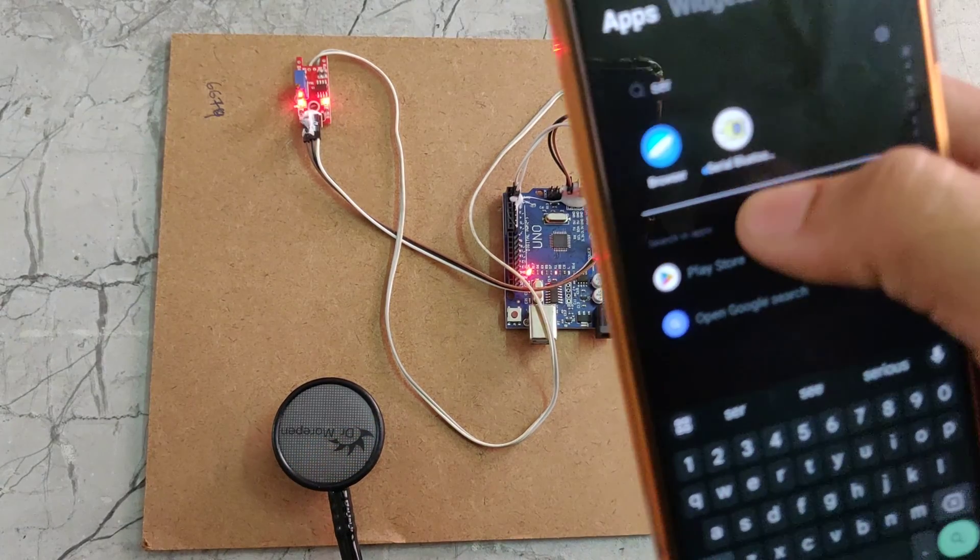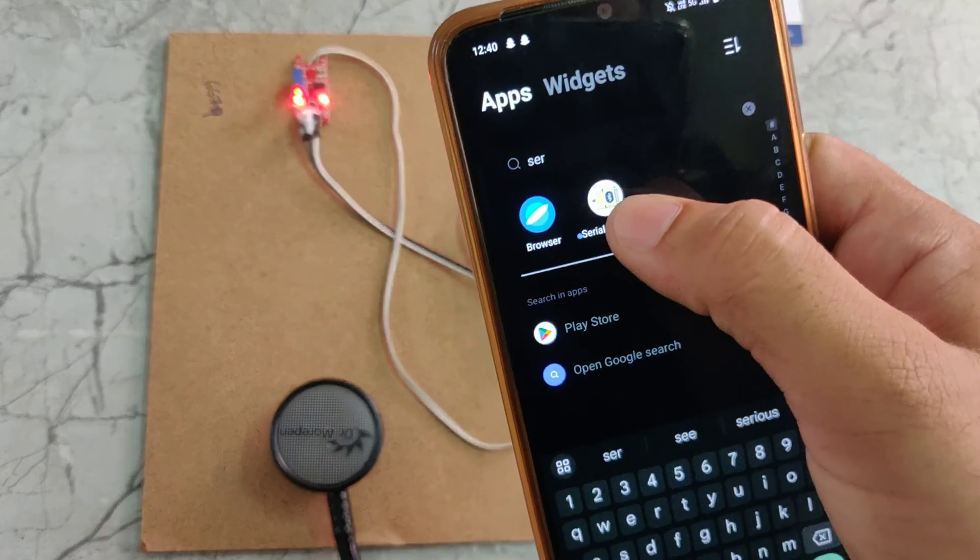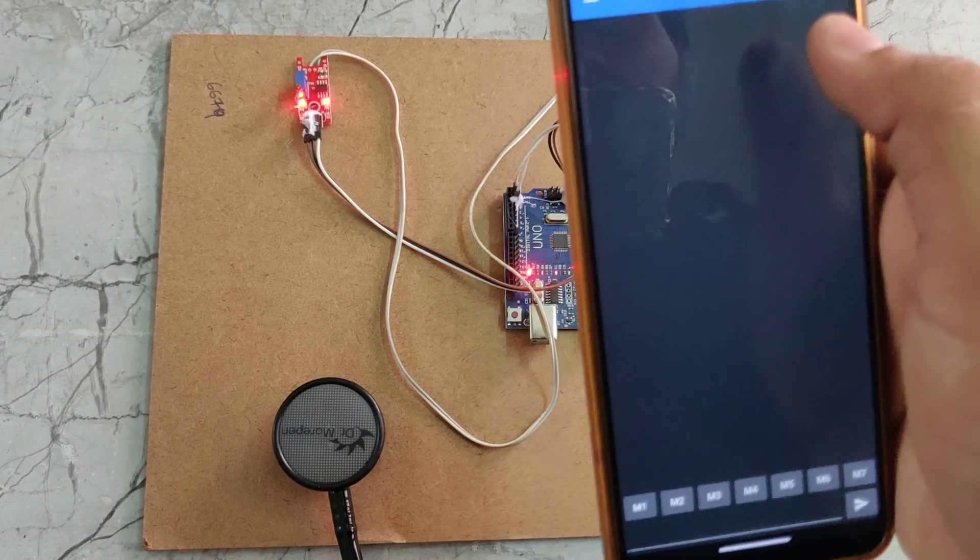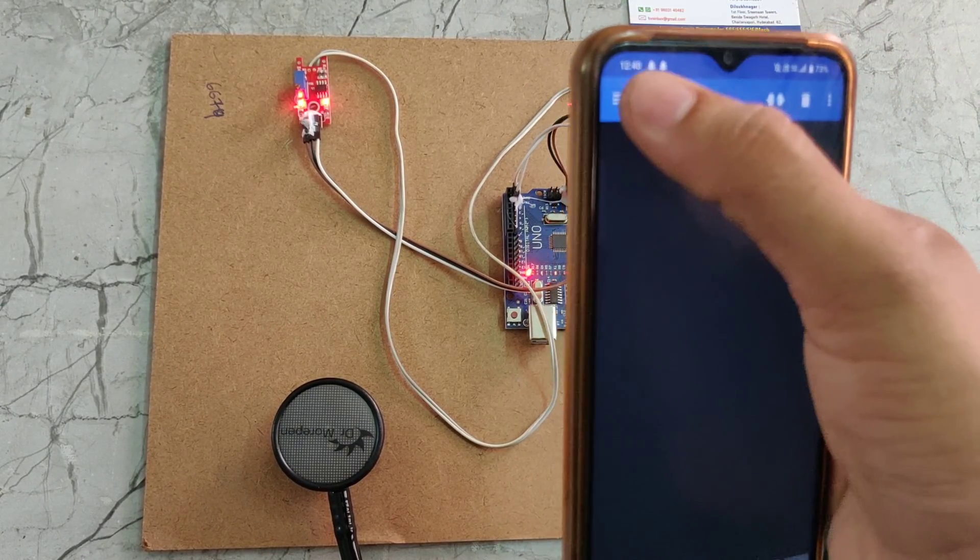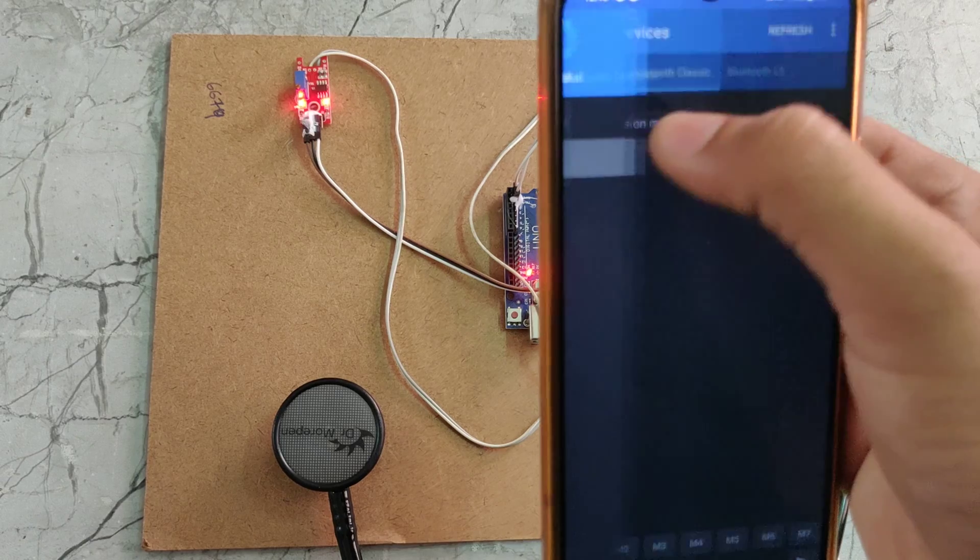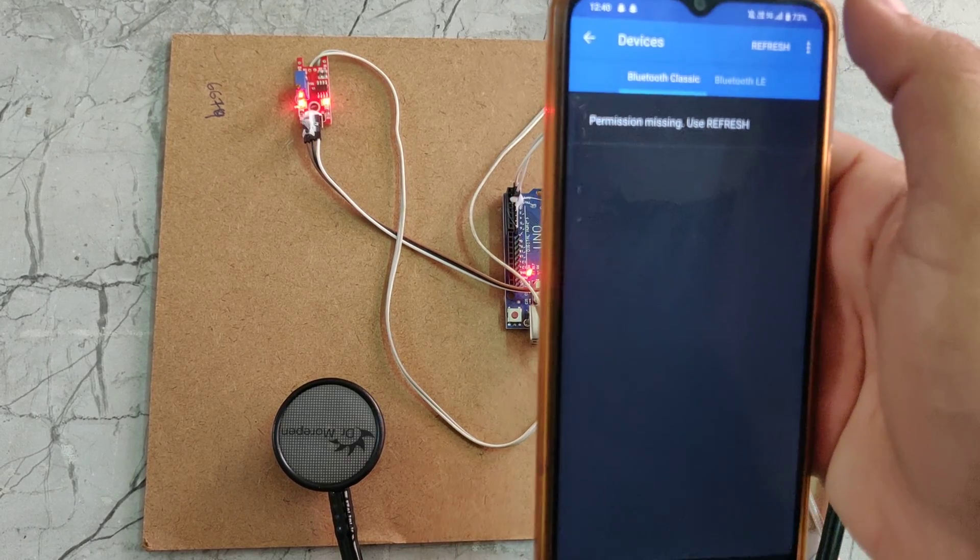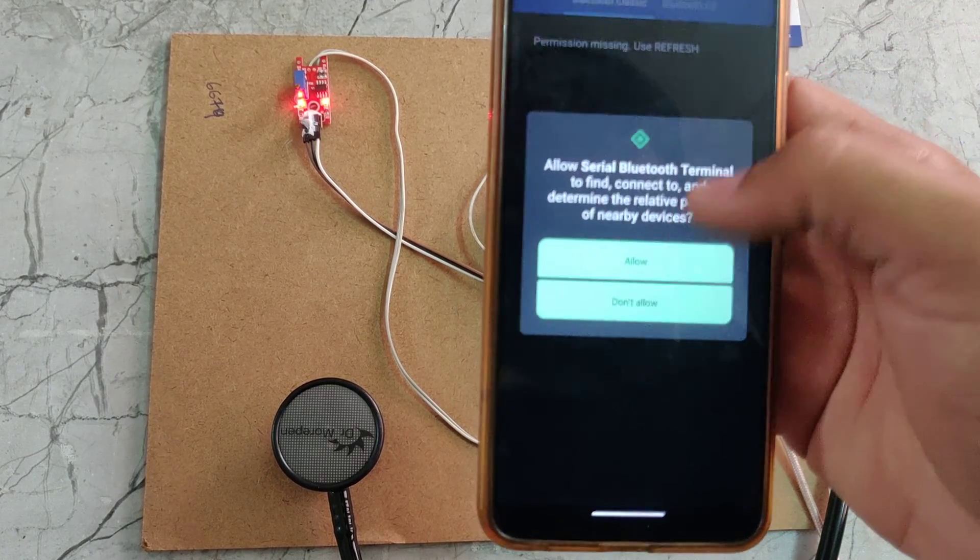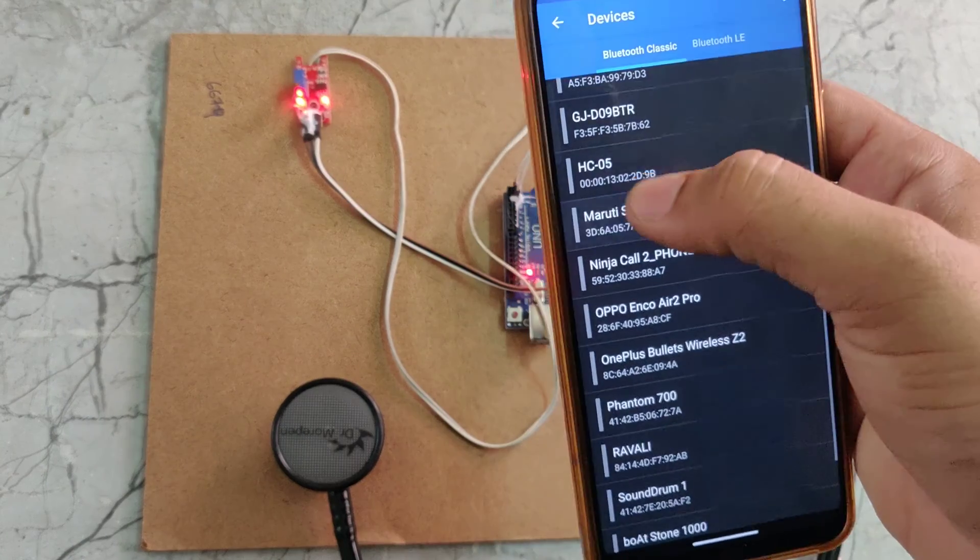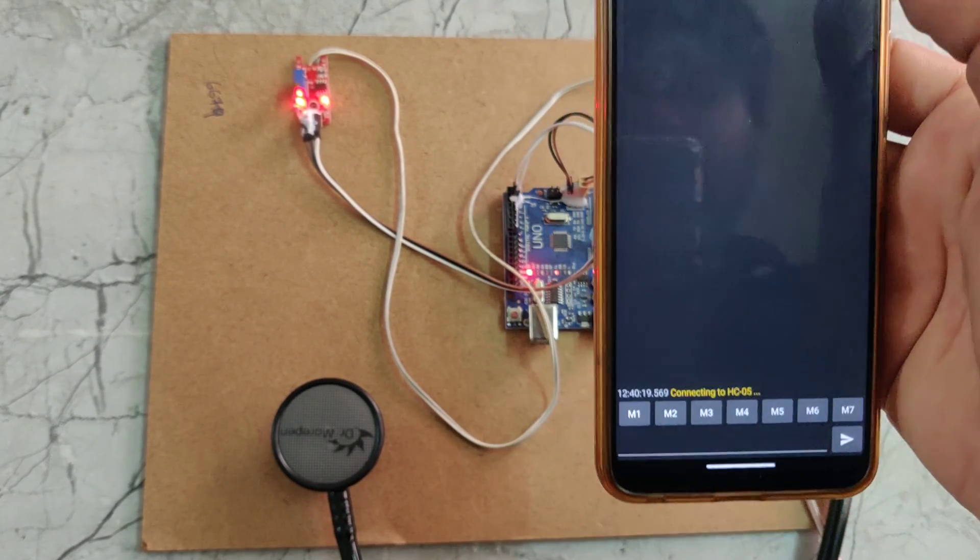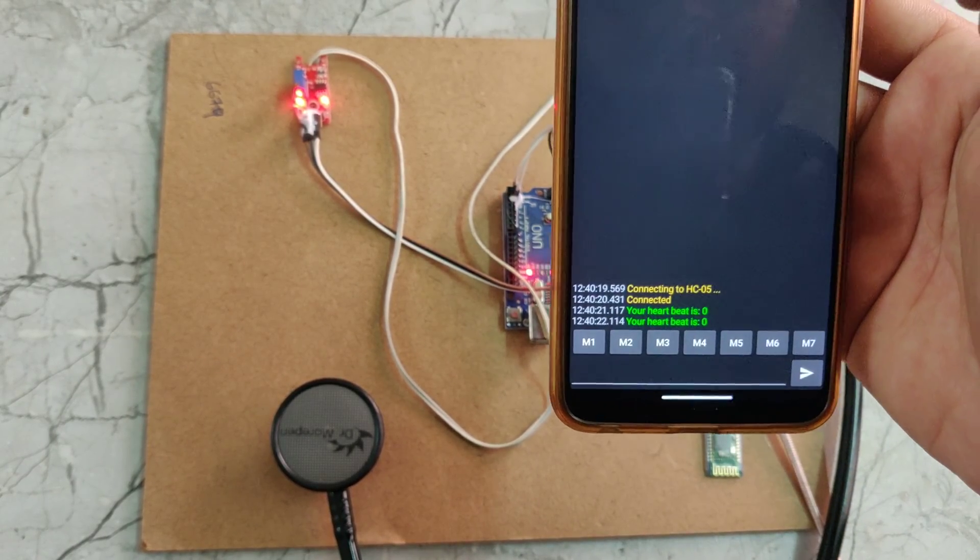Here we can see serial Bluetooth terminal. It is available in play store. We need to go for this one, go for three lines, and choose devices. We need to refresh it. We can see HC-05 here. Now it is connected.